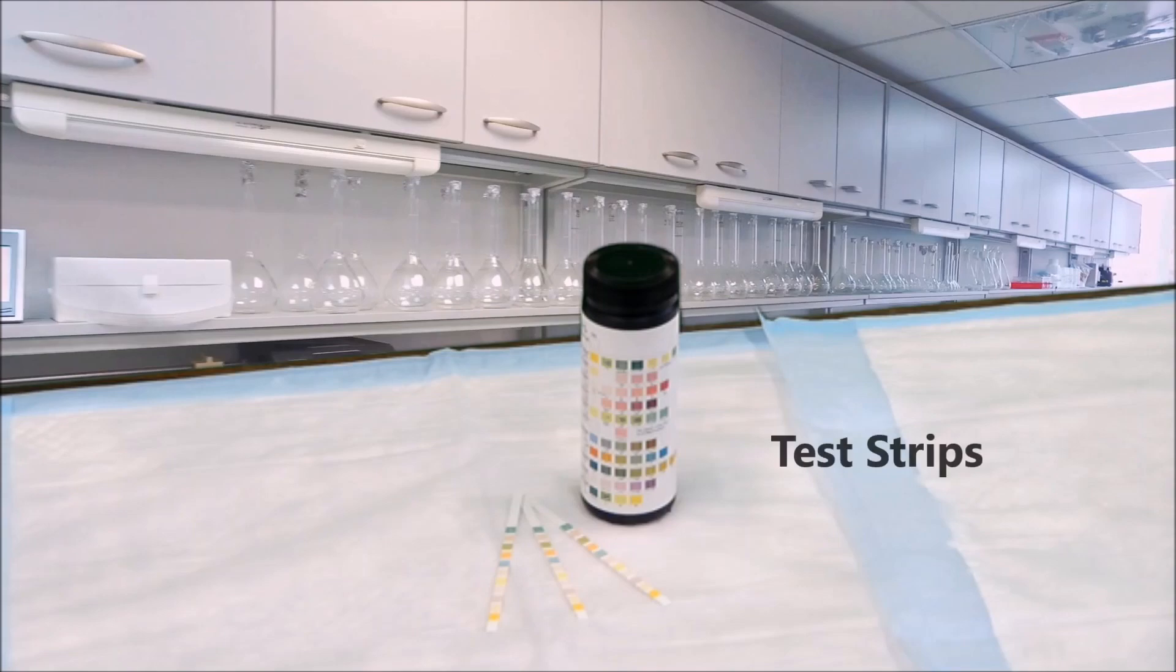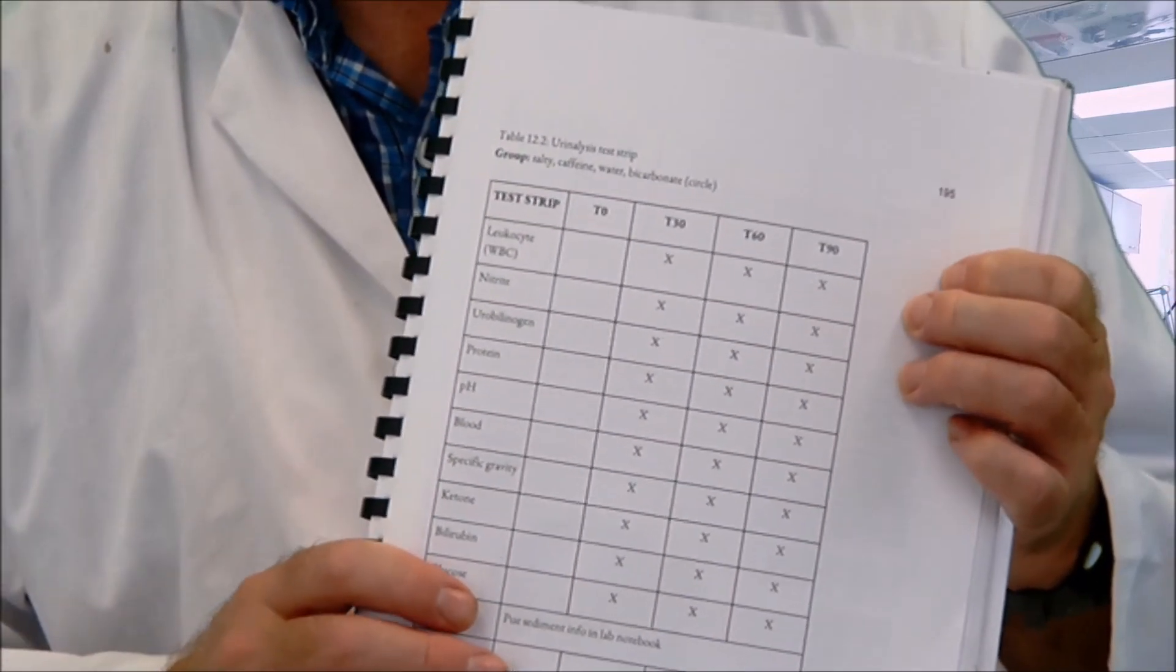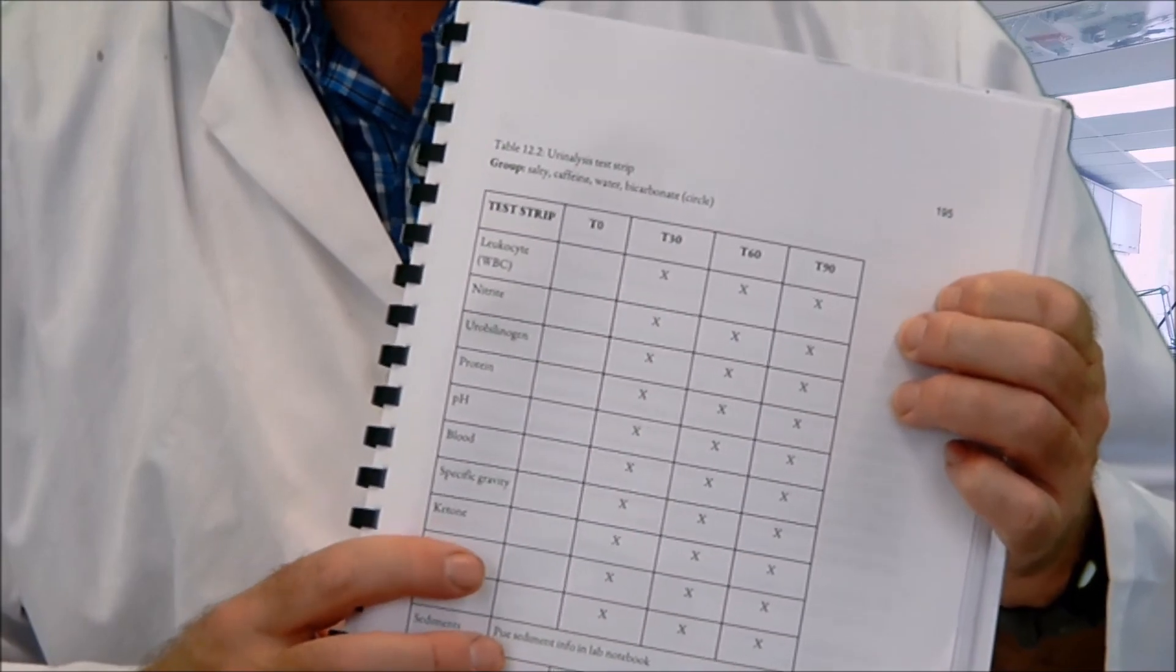Next, you will need three urinalysis test strips and accompanying color chart. You will also need the data entry table from page 195 of your lab manual.